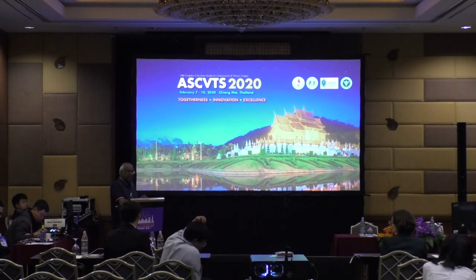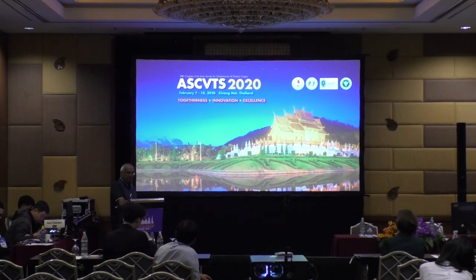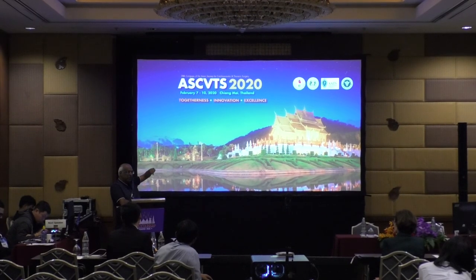Right. So all the standardization that's been done with strain, I think, enormously underplays the real world changes in strain that we get. I mean, you have trained in a good center where there is some attention to quality, and being critical of the number that you're getting. But I can tell you, in the U.S., I am deeply worried about strain. Everybody shows the bullseye, never shows where it came from, right? The bullseye always looks beautiful, but we all know transthoracic echo cannot be that beautiful. When you look at the two chamber, the apex is outside the sector, and yet the bullseye looks perfect. And if you look at the tracking, it is tracking a black space outside the sector. How is that even possible? So there is no critical analysis.